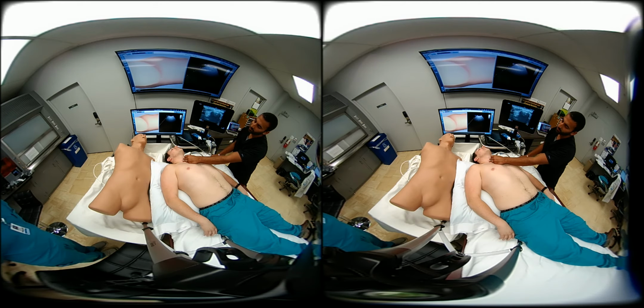But then to evaluate for the cricothyroid membrane, it is usually advantageous to scan in a long axis fashion by just rotating to the 12 o'clock position to get the ultrasound probe sitting on top, so you can see tracheal rings, cricoid cartilage, cricothyroid membrane, and the thyroid cartilage. Great.